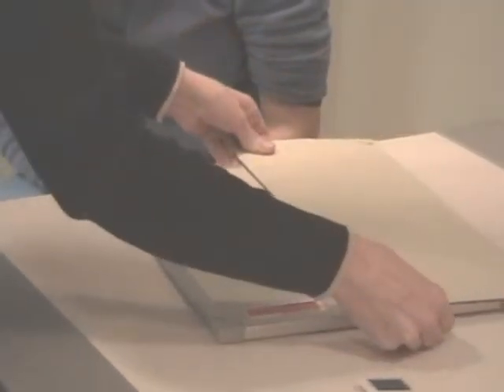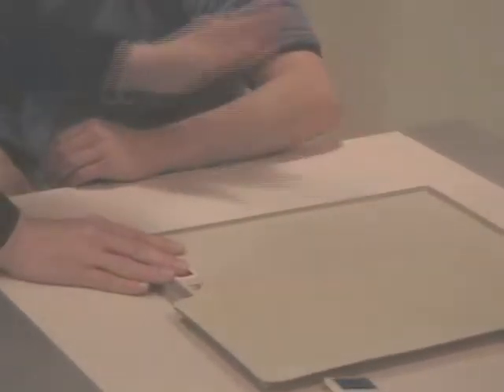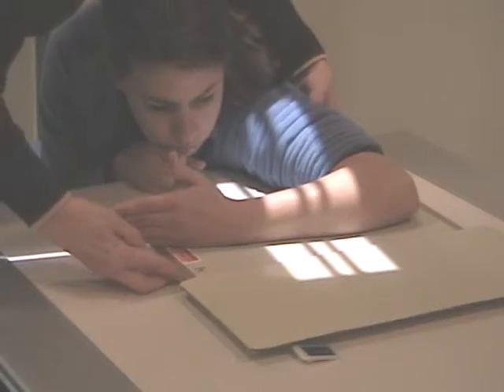Reverse the lead strip, turn the cassette, have her lean in so the humerus comes down. And I'm looking back here on the elbow. I want to have the clearance. I want the 1.5 inch clearance here. So it looks pretty good. So now I'm going to do my tube.